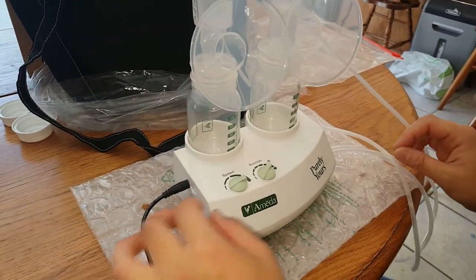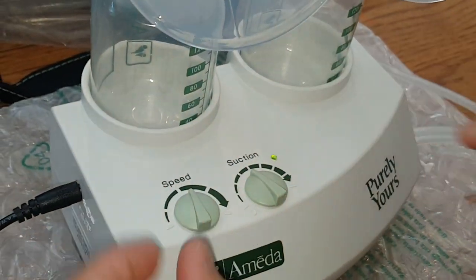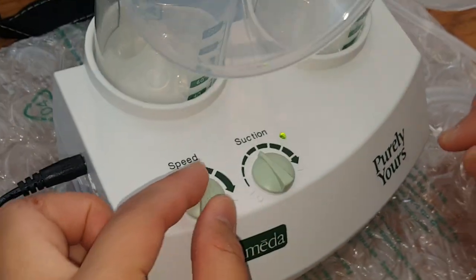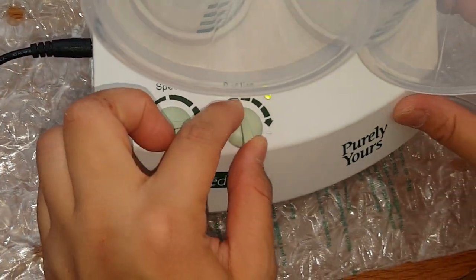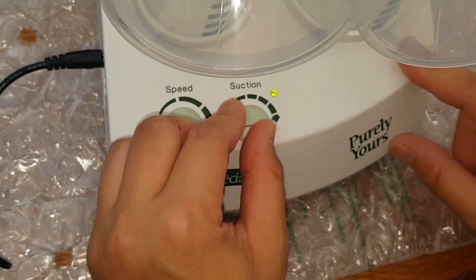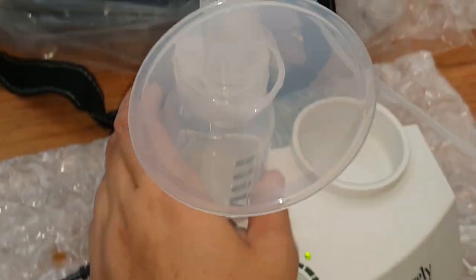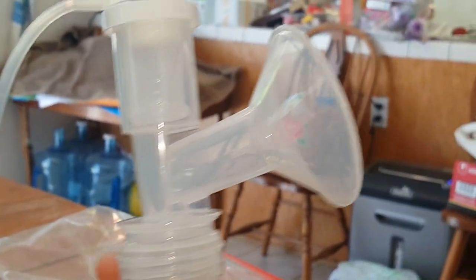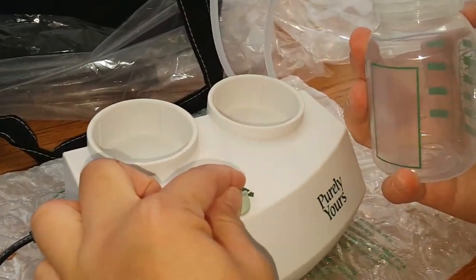Now we've got everything hooked up into the wall. You can adjust your speed if you want it to go fast, and your suction. If you want a lot of suction, you go all the way; if you want just a little bit, you turn it back the other way. Let me turn my suction up so you can see.